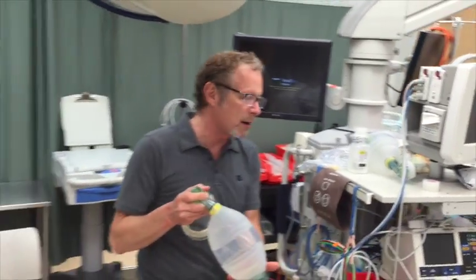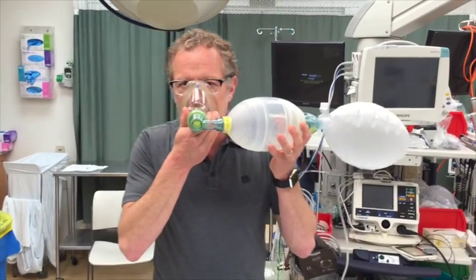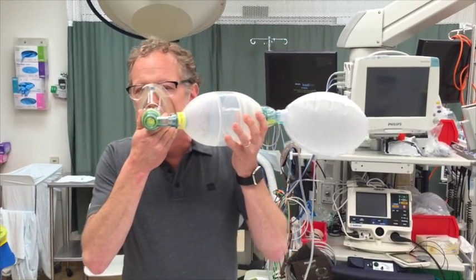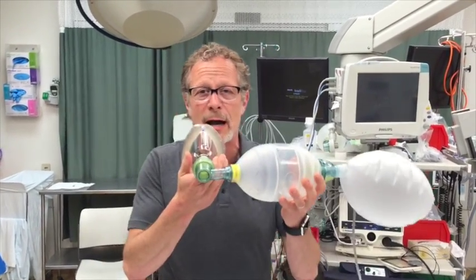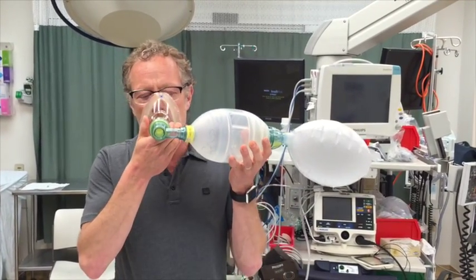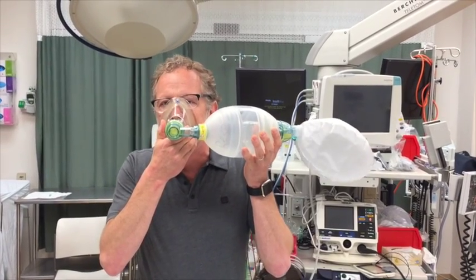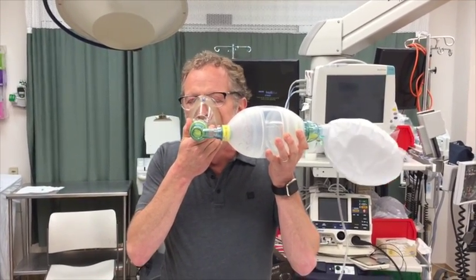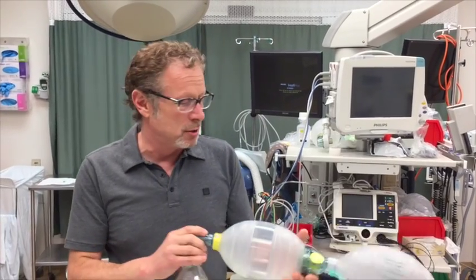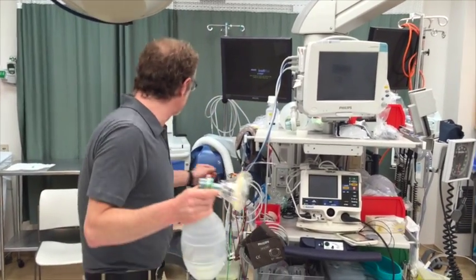So what we can do is go up to flush — beyond 15 liters — which in this system can apparently go beyond 15 up to about 30 liters per minute. With normal breathing at that flow, if I increase my respiratory rate and tidal volume, I'm able to match my minute ventilation.